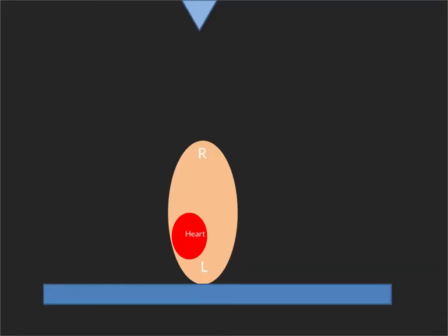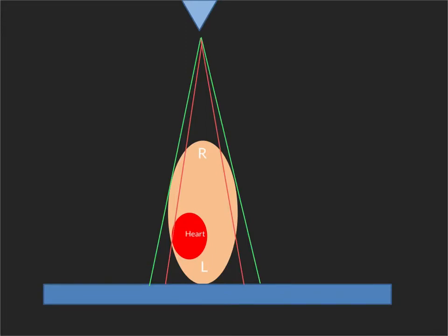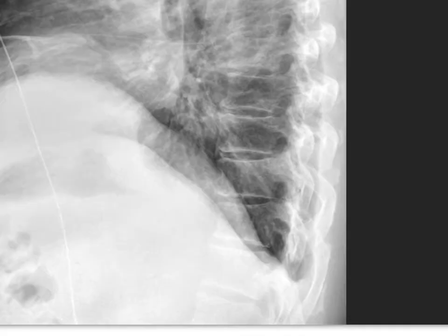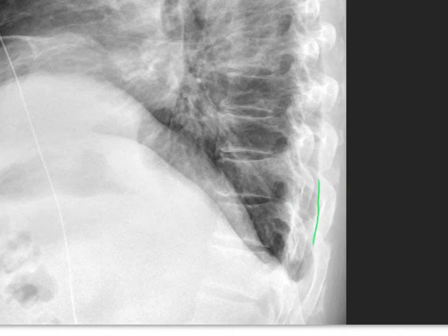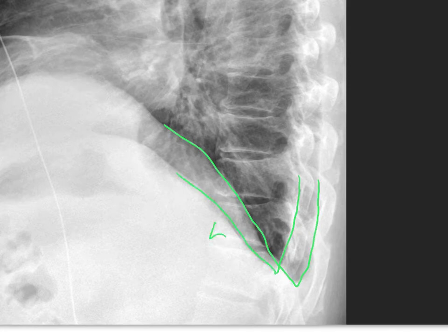The final clue to use when all else fails is to do with magnification of the right hemithorax relative to the left, because the right side of the patient is furthest away from the film in a lateral chest X-ray. You can see here how equivalent points in the left and right hemithoraces are being magnified differently, with the right appearing larger. So this larger and more posterior set of ribs — more posterior because the hemithorax is larger — is going to be the right, and the smaller and more anterior one is going to be the left. We can follow down the right to the posterior costophrenic angle, where it joins the right hemidiaphragm, and follow down the left to the posterior costophrenic angle, which is the left hemidiaphragm.